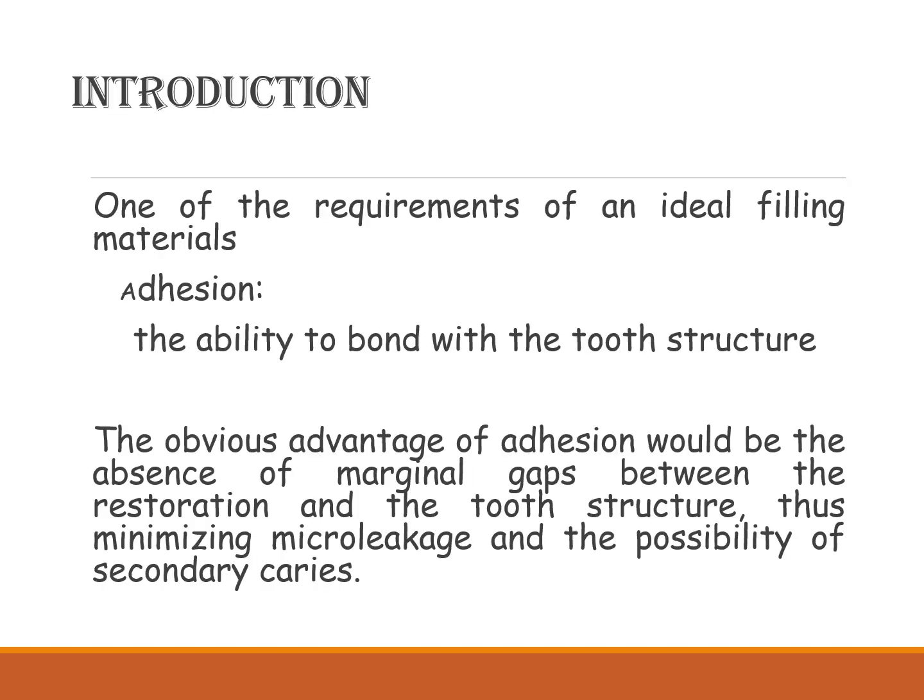This is a small class on acid etching. One of the requirements of an ideal filling material is adhesion, the ability to bond with the tooth structure. The obvious advantage of adhesion would be the absence of marginal gaps between the restoration and the tooth structure.